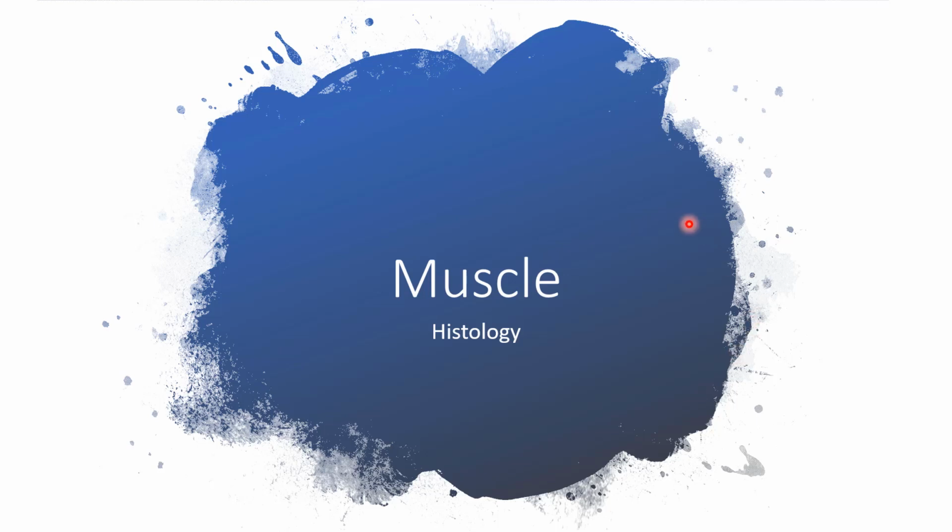Hello everyone. This video is going to go over the muscle histology that I require my students in anatomy to know. So the first one we will be showing is skeletal muscle. Skeletal muscle is located in all of the body muscles. So your deltoid, your latissimus dorsi, your biceps, your triceps, all of that is skeletal muscle.